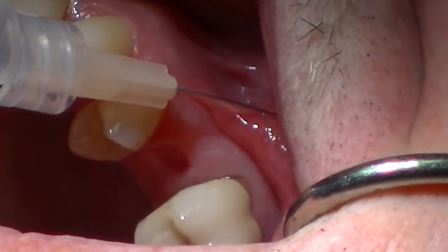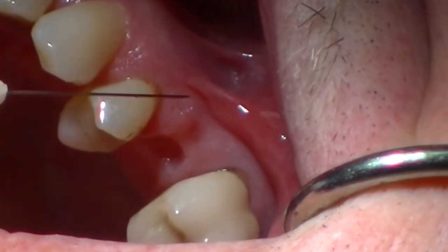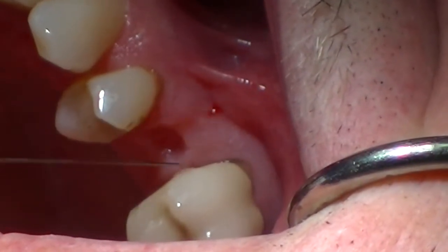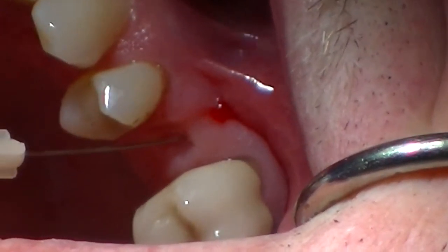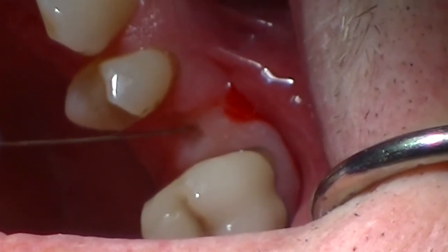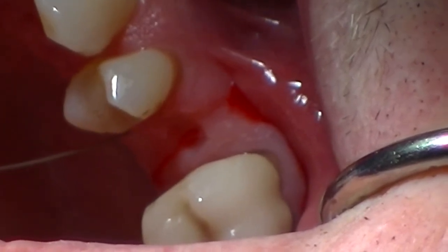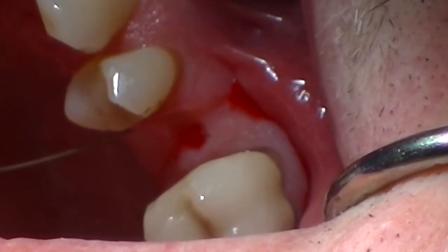I'm simply going to take my needle and walk up the ridge to the palatal area. What I want to do is basically blanch. When I'm doing this, I also want to look at the mucogingival line to see where the attached gingiva is. Here it's apparent that we do have plenty of attached gingiva on the facial aspect of the crestal ridge.